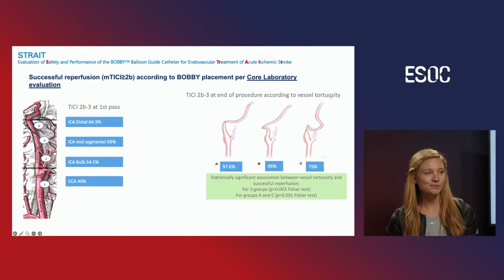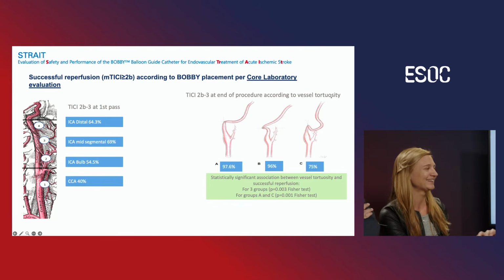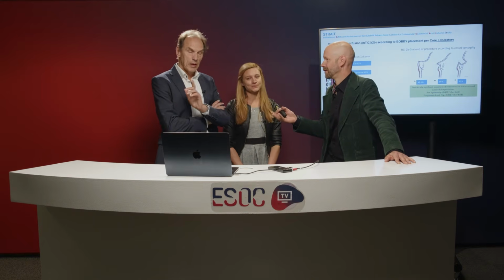So why is it so important to bring the catheter up to the skull base? Tobias will tell you. And what you discussed here, that you really have to have control over the balloon guide, underlines further that you need a little bit of experience using it. But I know that some of our colleague physicians say that with the balloon guide, you have this risk of making dissections, and that's exactly when you let it go up while you push.